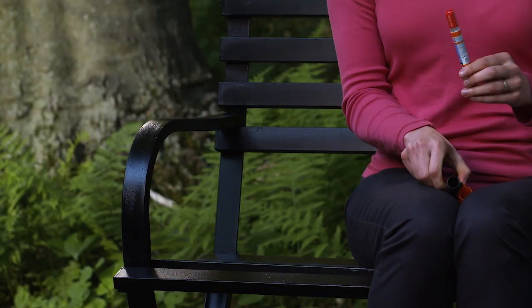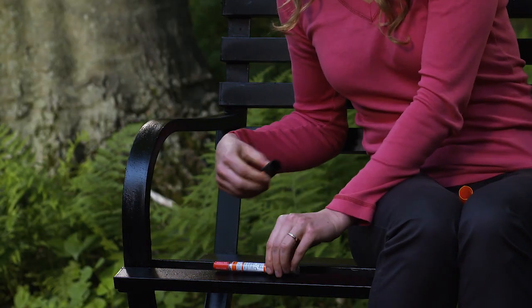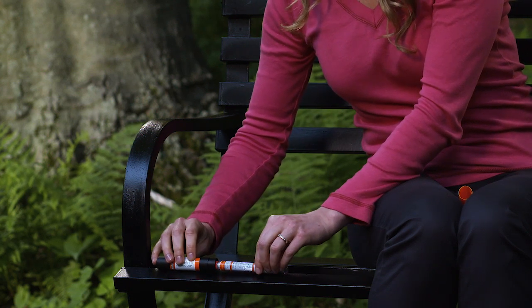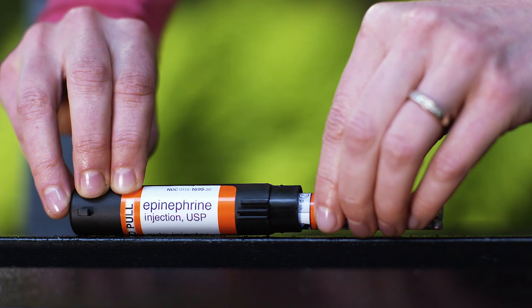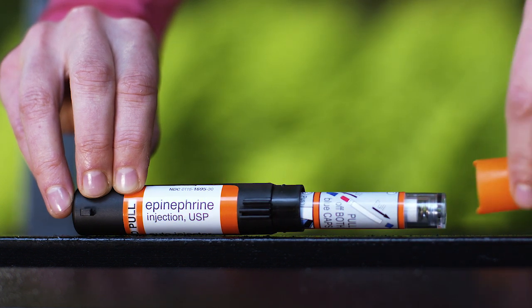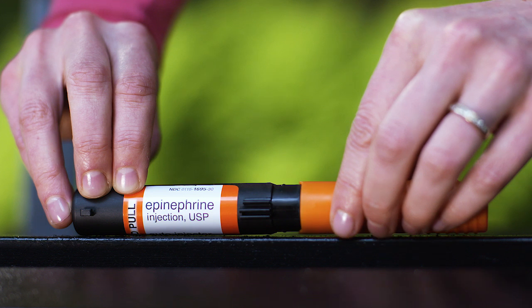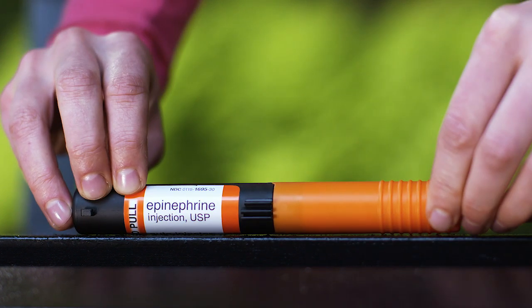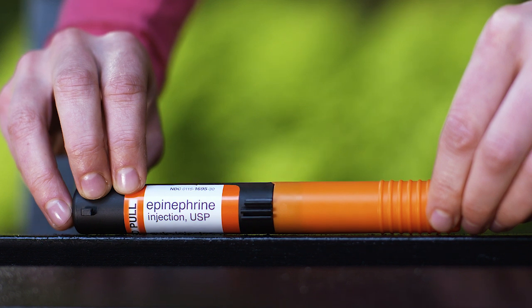Lay the labeled half of the carrying case cover down on a flat surface. Use one hand to carefully slide the end of the auto-injector, needle first, into the labeled carrying case. After the needle is inside the labeled cover, push the unlabeled half of the carrying case firmly over the non-needle end of the auto-injector. Never try to take the auto-injector apart.